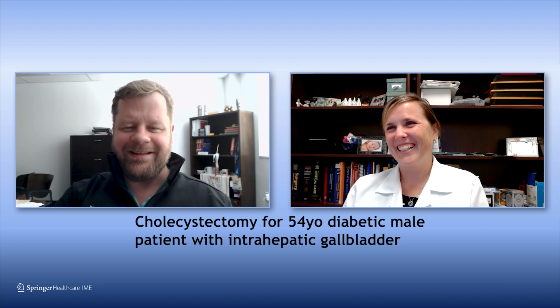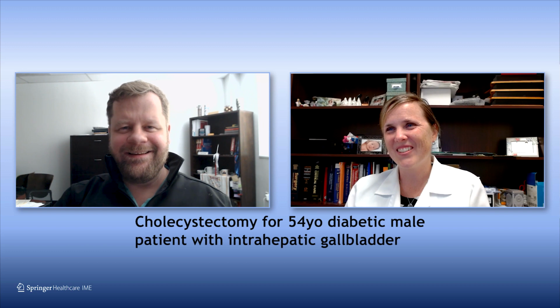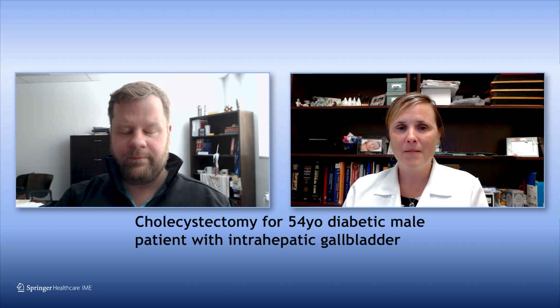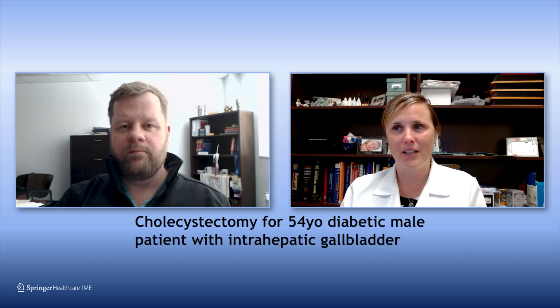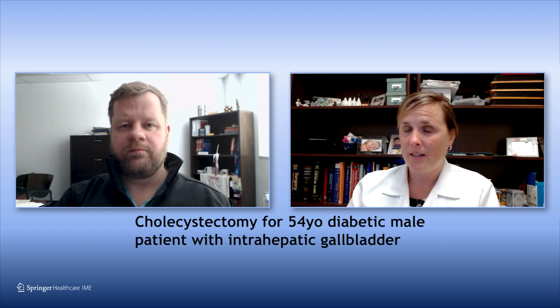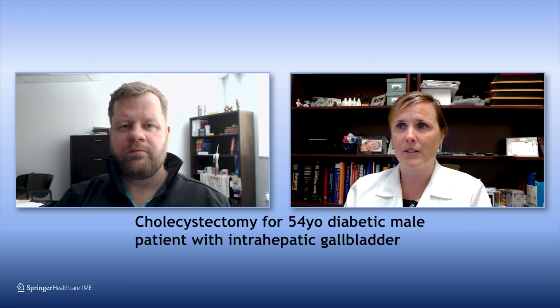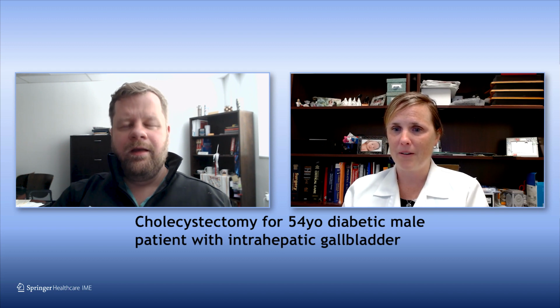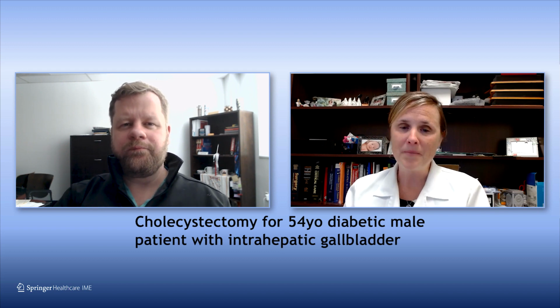That's great. So after a difficult dissection, you get really great hemostasis to the best you can with electrocautery, but you've now got the raw surface of this liver bed, and it's oozing diffusely. So I just wanted to talk a little bit about agent selection for this case. Again, there are a lot of clinical factors and performance factors that we should consider. So I don't know if you want to go first and talk about what you'd be thinking about, and then I can give you my thoughts as well. Sure.